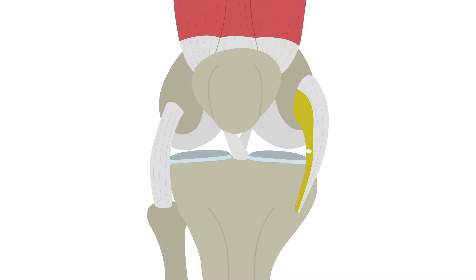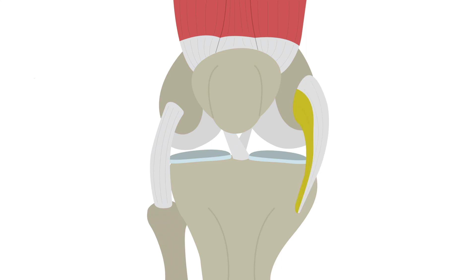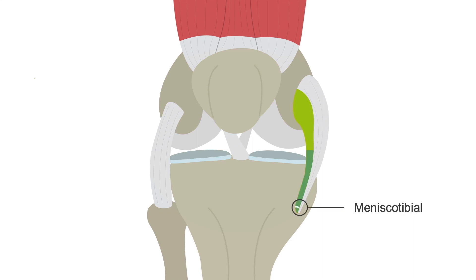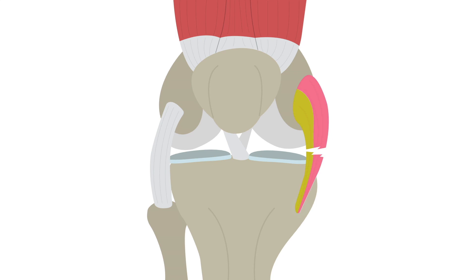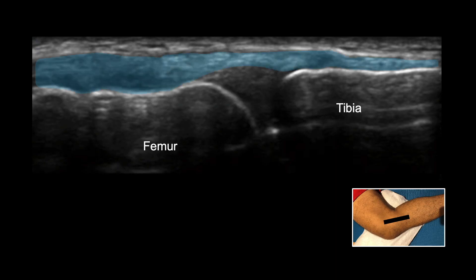MCL partial tears or grade 2 sprains can be localized to either the deeper or the superficial layer. When the deeper layer is involved, we can further localize it to either the menisco-femoral portion or the menisco-tibial portion. In full-thickness tears, both the superficial and deeper layers are torn with adjacent effusion and/or hemorrhage. Here is an example of an MCL tear on ultrasound — a longitudinal view showing a grade 2 sprain or partial tear, with the fibers of the menisco-femoral portion of the deep layer involved.